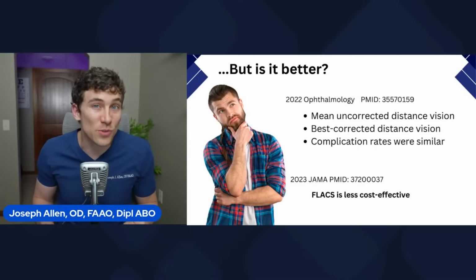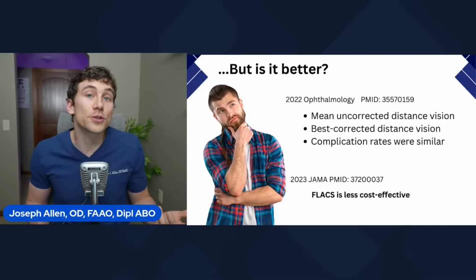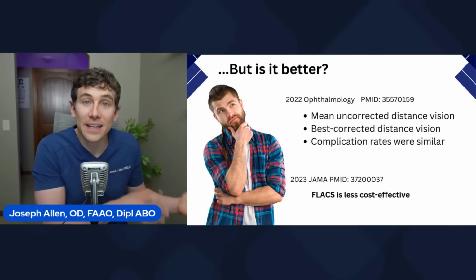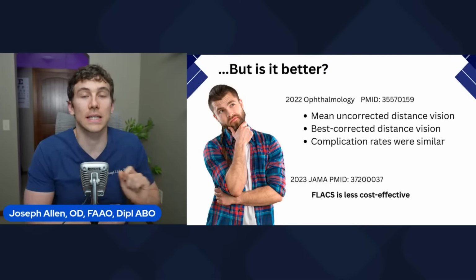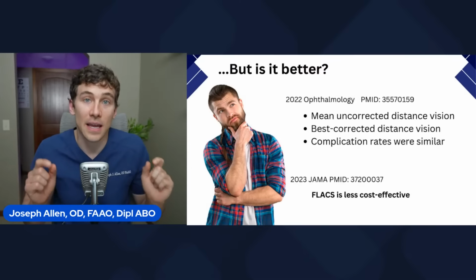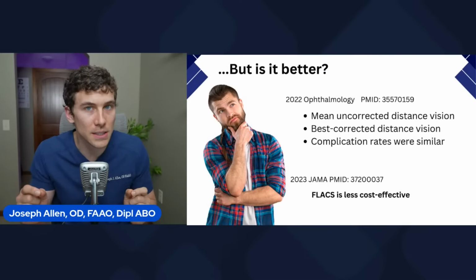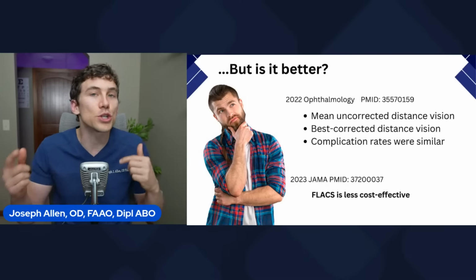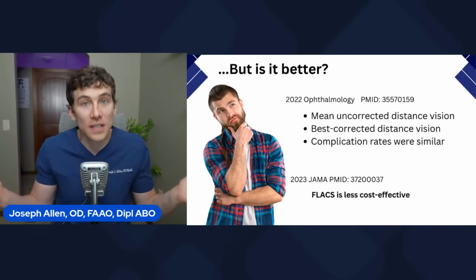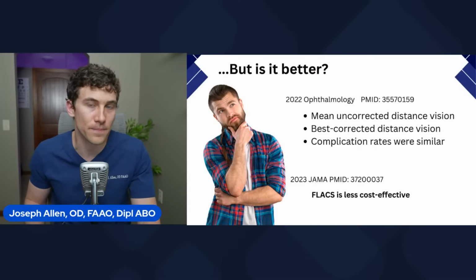I think it's important to address that, again, because there is this cost difference. However, I know a lot of surgeons who still, despite knowing this, will still talk about and recommend the laser procedure, especially in the case of premium or specialty lens implants, because again, the laser procedure is a little bit more precise, and they can maybe reduce potential complications or side effects. Although, even though we know the end results are oftentimes very much the same.